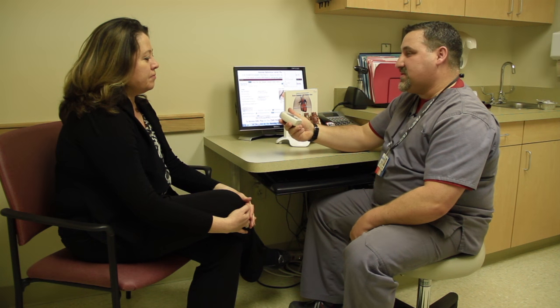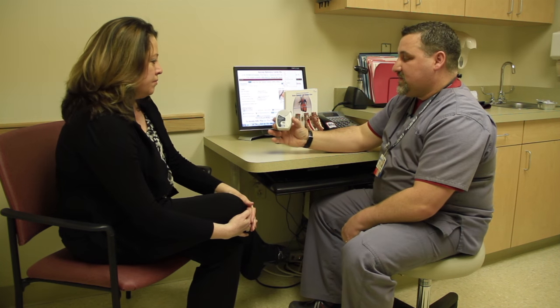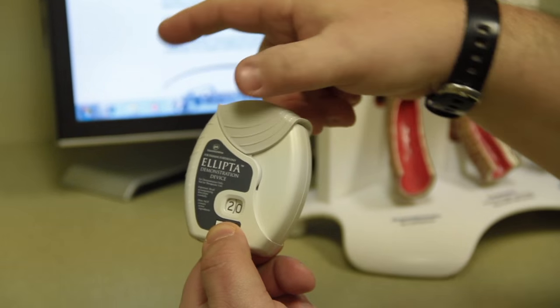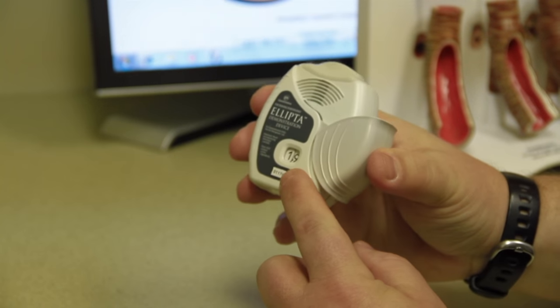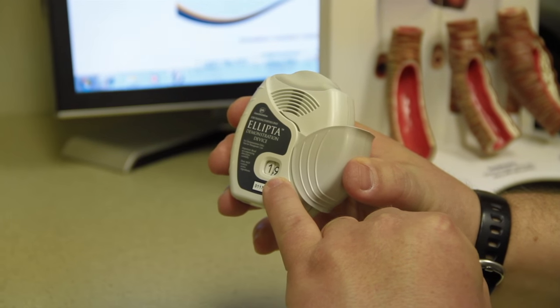Your provider has ordered you to take an Ellipta device. The device will look like this when you get it. There is a lid on top, which you will have to slide down to expose the mouthpiece. When you slide the lid down, you will hear a click. That means the dose has been loaded and it's ready to take.